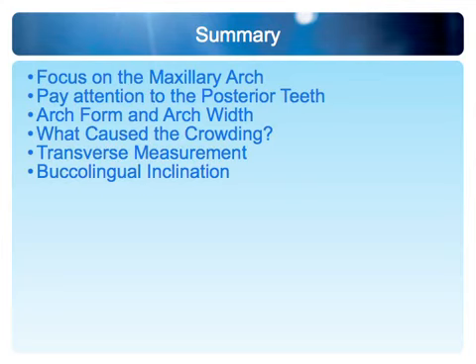And so now you have to look at the size of the teeth, the health of the periodontal structures, and start to determine, okay, where is my arch form? Where is my arch width? How about that buccolingual inclination?